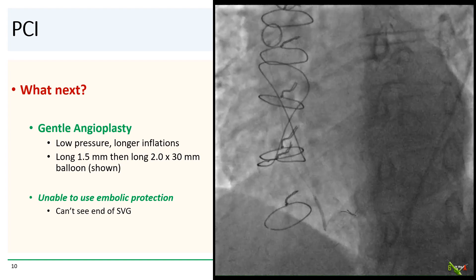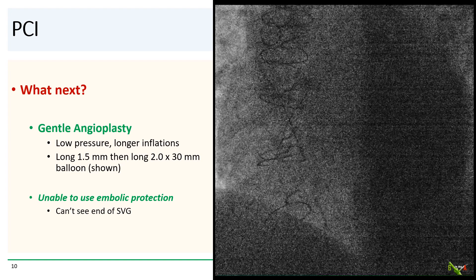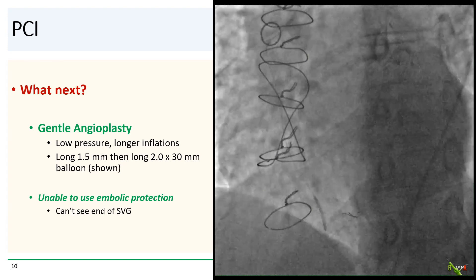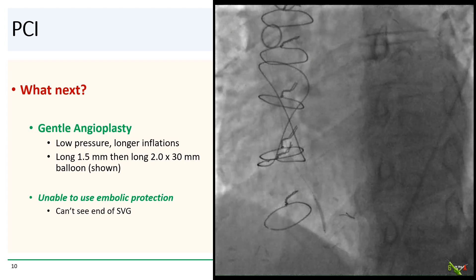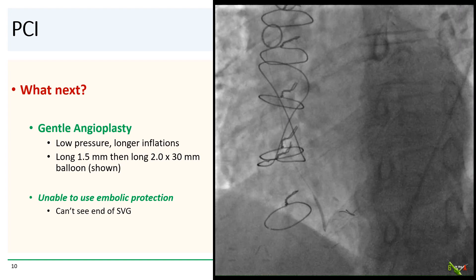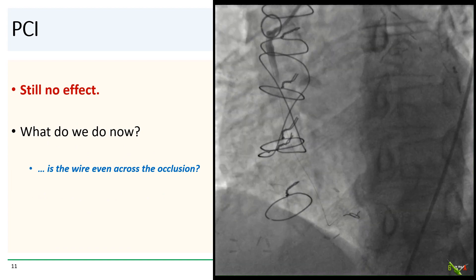We decided to gently balloon the lesion. We couldn't use an embolic protection device like a filter wire or spider, since we couldn't even see the end of the vein graft. So we gently dilated the lesion with a 1.5 mm and then a 2.0 by 30 mm balloon, using small balloons at very low pressures and long inflations. Since we had no embolic protection device, the idea was to gently open a channel without embolizing too much thrombus. But there was still no flow.